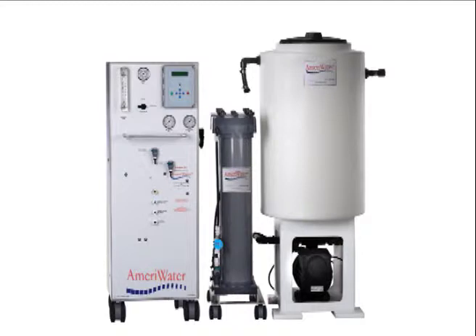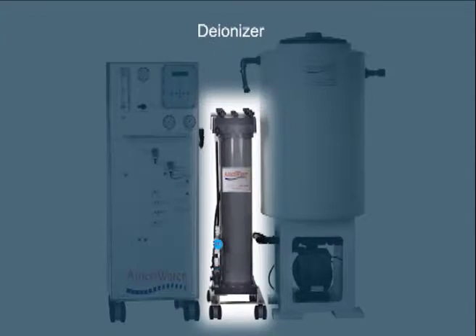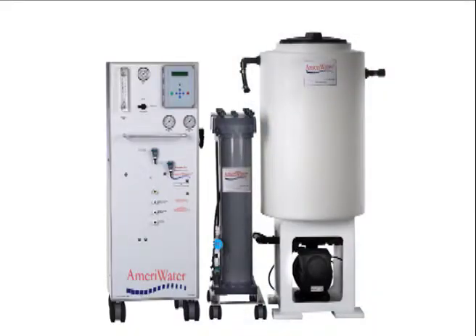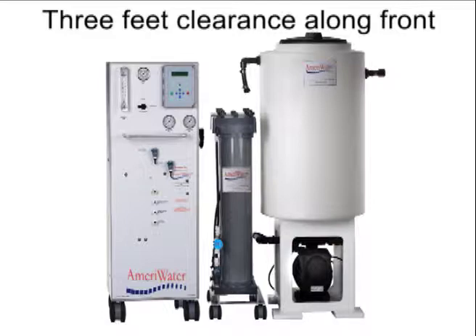Once you've unpacked the units, set them up as shown here, with the reverse osmosis unit on the left, the deionizer in the center, and the storage tank on the right. To allow easy maintenance, be sure there's at least one foot of clearance on either side of each unit and three feet of clearance along the front.